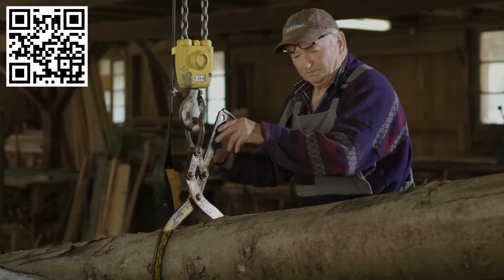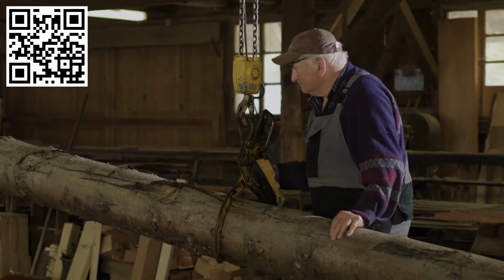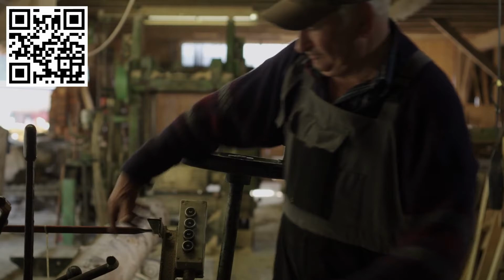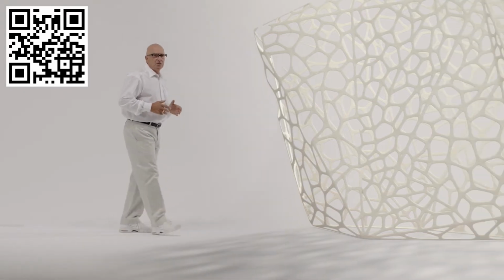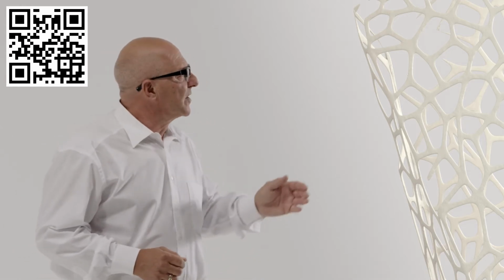Unfortunately, what works well for cutting wood does not work well for cutting bone in a live patient. Aside from the fact that wood processing machines typically produce a broader cutting width than the saw, they are invasive tools that cannot be retracted quickly or easily from the cutting medium and cannot adapt appropriately to patient movement. When cutting bone, it is important to make thin cuts and that the bone is not overheated. Thermally damaged bone is known to slow down the healing process, and it is well known that when cutting with conventional mechanical methods, there is a lot of heat brought to the system due to the friction of the blades.